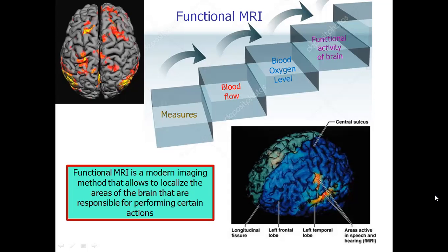One more option of MRI is so-called functional study. What is the difference between MRI and functional MRI?